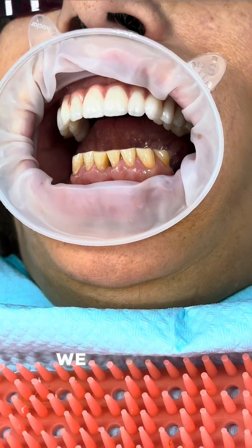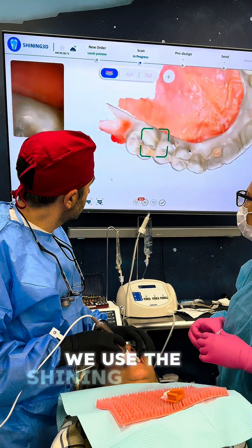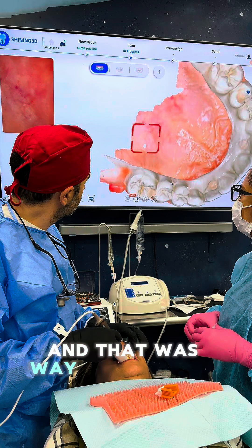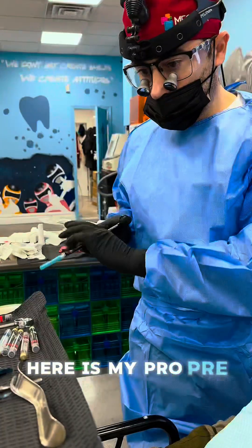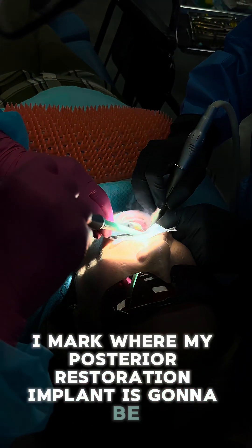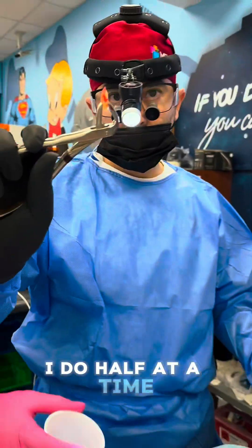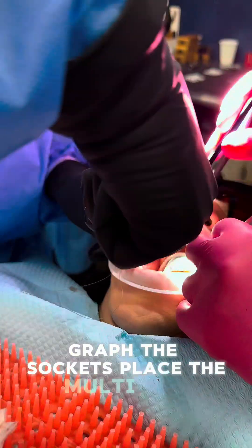This was done with no sedation - we gave her bilateral nerve blocks. While waiting, we used the Shining scanner to scan the upper with the new update, which was way better than last time - no double scans and it scanned pretty quickly. We then took out the teeth, marked where the posterior implant was going to be, and worked in quadrants - taking teeth out and placing implants half at a time.